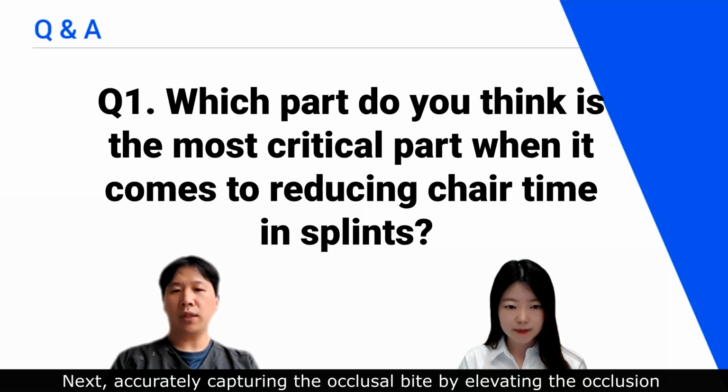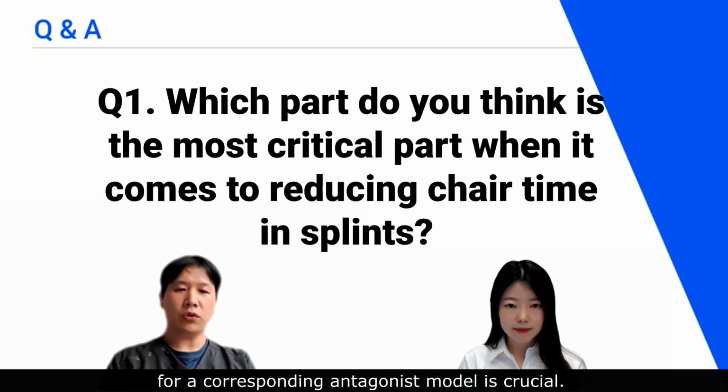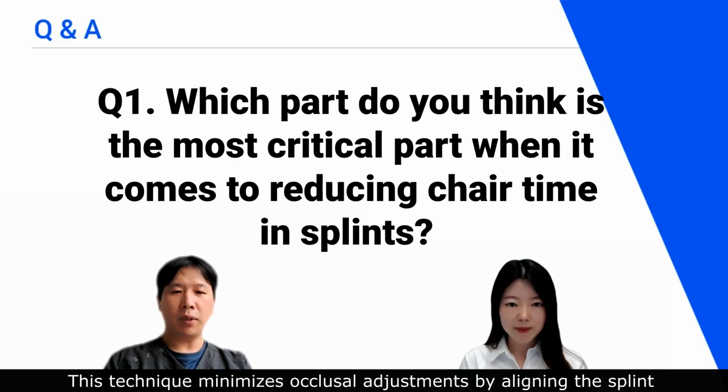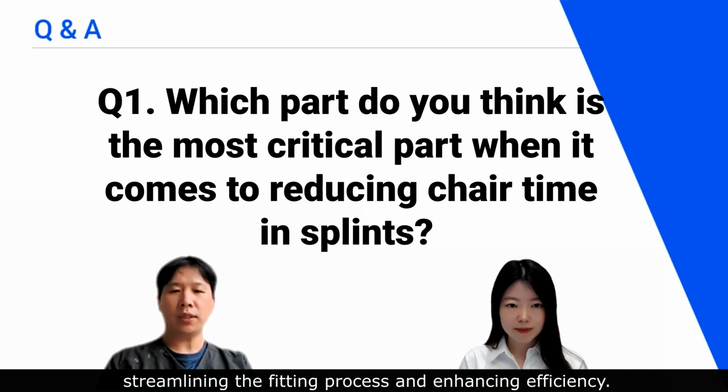Next, accurately capturing the occlusal bite by elevating the occlusion and using mandibular movement recordings for a corresponding antagonist model is crucial. This technique minimizes occlusal adjustment by aligning the splint with the patient's natural bite and movement, streamlining the fitting process and enhancing efficiency.